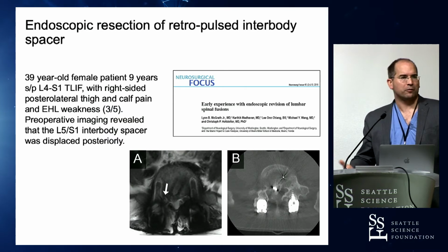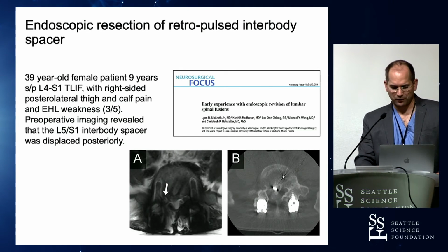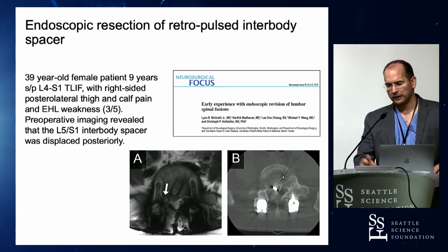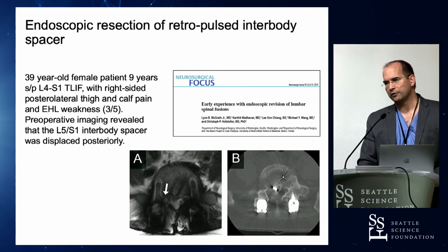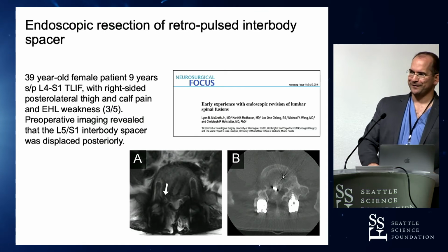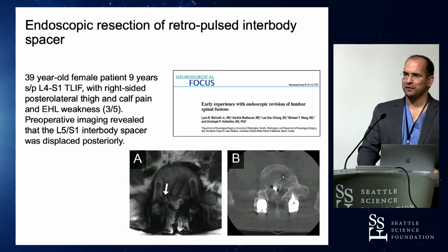Last little indication, we wrote a paper on that too. What if you've already done your traditional surgery, put in pedicle screws, everything is happy, you provided your patient with your final surgery, as we always sell. I have a lot of patients that come to me and say, I saw this surgeon, he offered me a final surgery, and I was like, yeah, right. You know what the end of a degenerative spine disease is, right? Everybody knows it, right? What's the end of the degenerative changes in your spine?